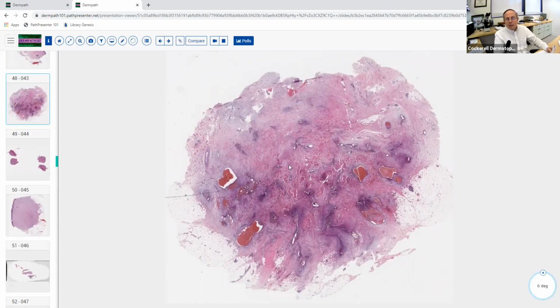Okay, this is one you probably will not get on the exam, but nevertheless, once again, if you looked at this and you figured this out, congratulations. And always if you can get a tough lesion on your own, when the board asks you something, it's better to over prepare for these kinds of examinations than to under prepare. So you should go in feeling like I've done way more than I need to, so I know I'm going to pass, and then maybe you'll ace it.